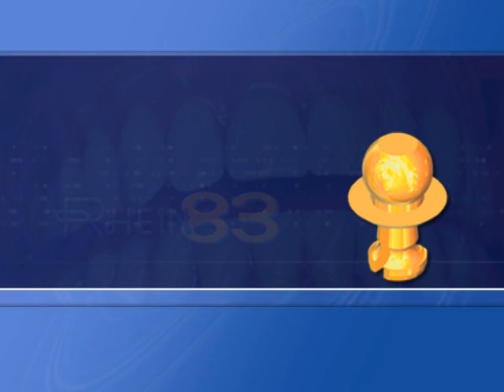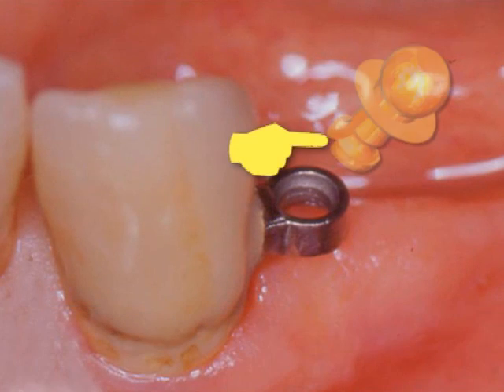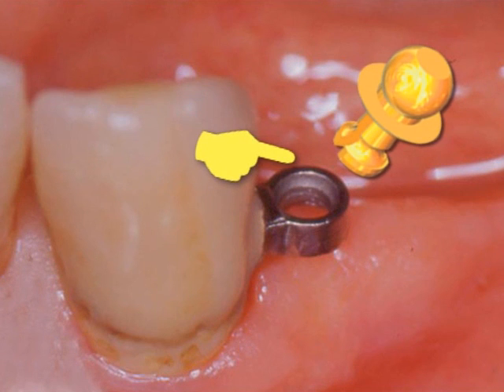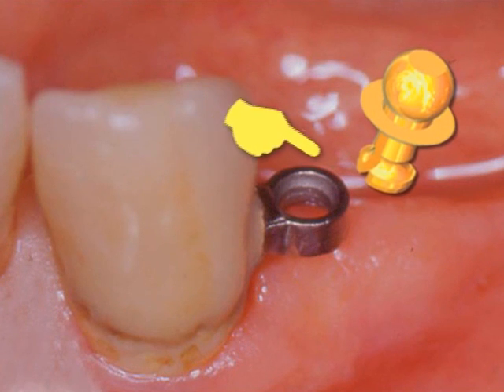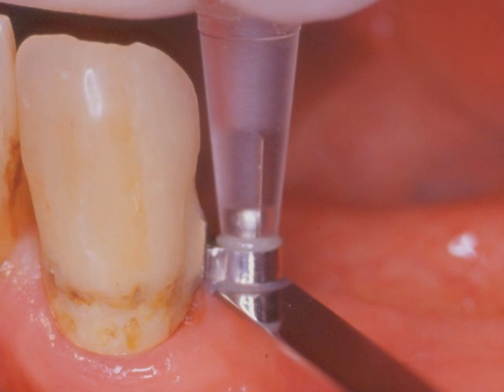Solid sphere — one size only, 1.8 mm diameter. The spring-like mechanism of the sphere's neck, once inserted into the old ring attachment, clicks and locks down into place. It'll be enough to cement with composite to seal the new sphere on the attachment.